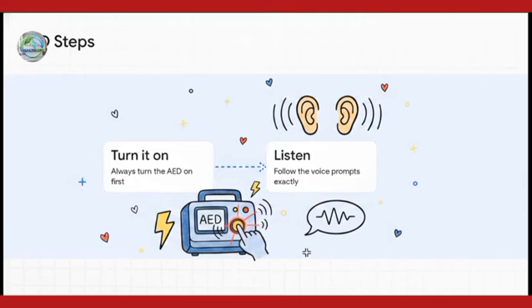I really need to hammer this home because people tend to overcomplicate it in the heat of the moment. The very first thing you must do when an AED arrives, even if you've never touched one in your entire life, is simply turn it on. That's it. Step 2 is just listen. The machine is completely voice-guided and will literally speak to you, telling you every single step to take.